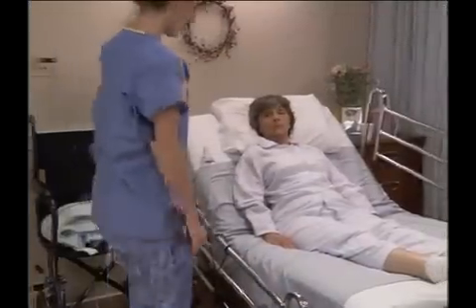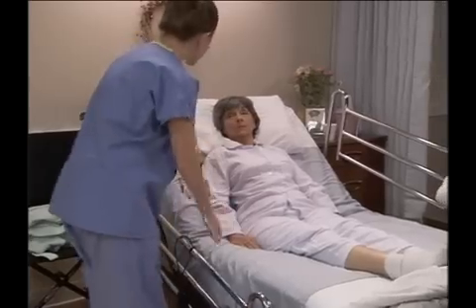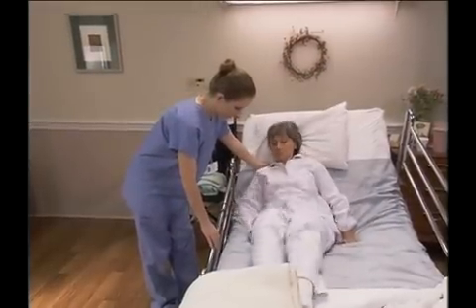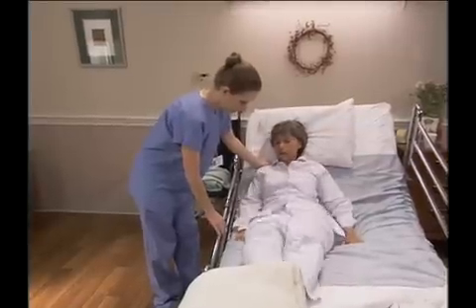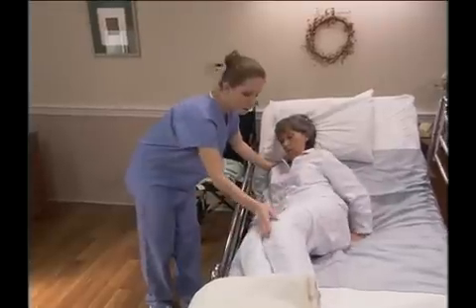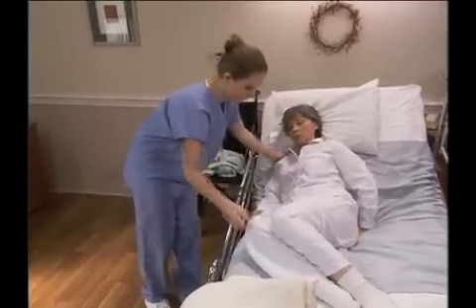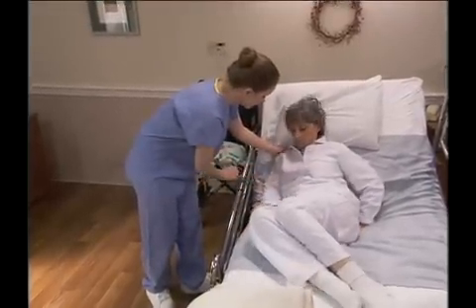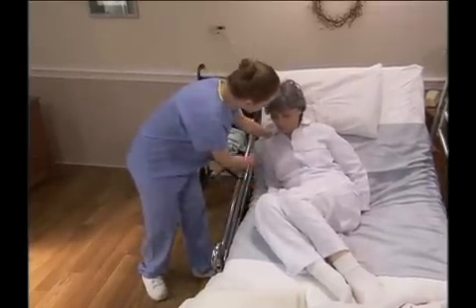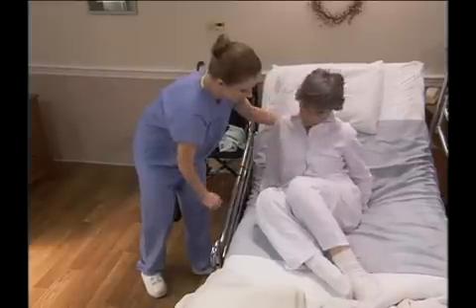Help the person to move toward the side of the bed where the wheelchair is located. Then, help the person sit on the edge of the bed. To do this, first have the person roll over onto her side, facing the side of the bed where the wheelchair is located. Have the person flex her knees and position her arms as shown to enable her to prop her upper body up and push off the bed.